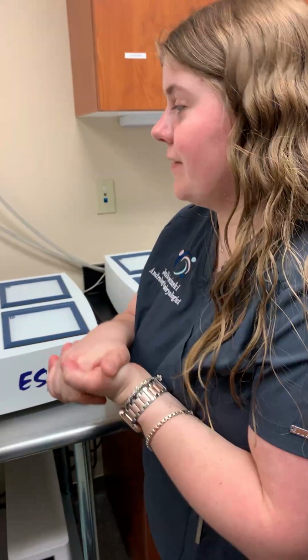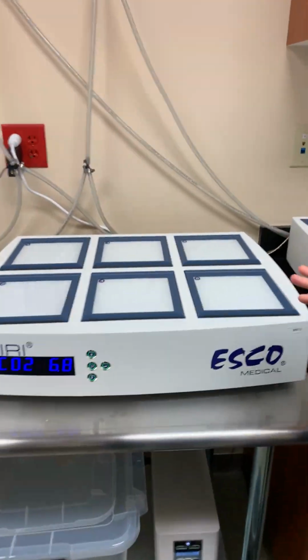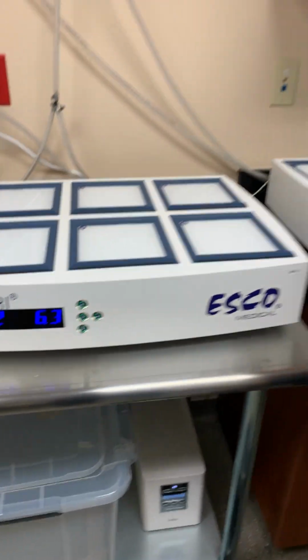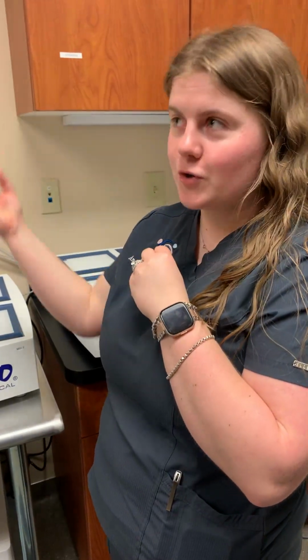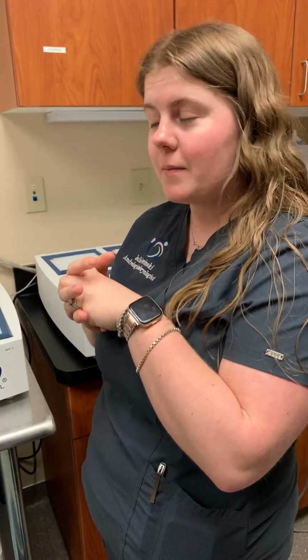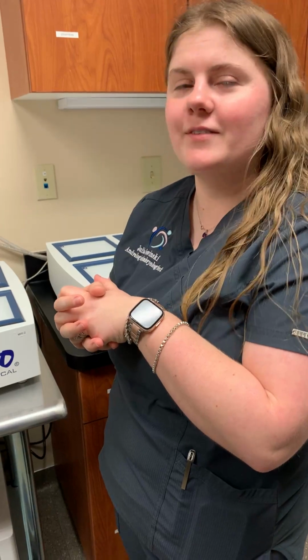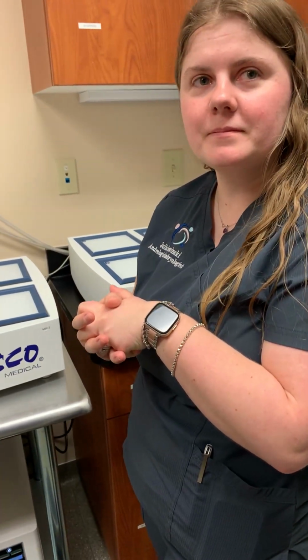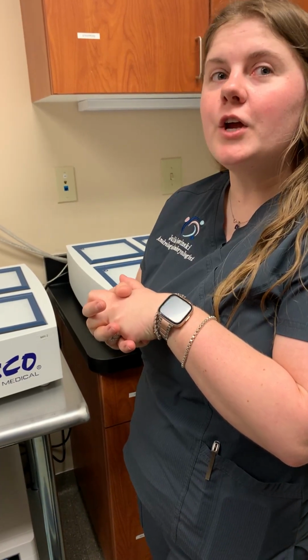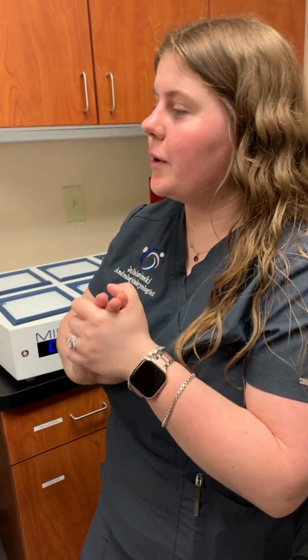And it comes down, comes into our incubators. It's got different pressures that it's worked its way down to. It starts a bit higher out in the tank room and is worked down to the proper pressure that we need for these incubators here. They are very neat in that the way they operate is trying to be the most efficient for not only patients' development with their embryos, but keeping those gases at a really good level without drawing too much of our gas, so that it's not expending a lot of it. So it's a kind of resource protection along with our patient protection. That's really excellent to have, kind of a 2-for-1 deal there.